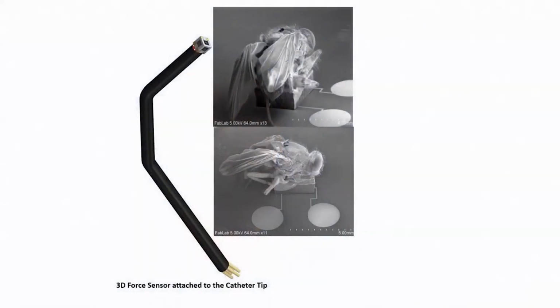Right now, this is a dead housefly that we stuck with silver paste on a flexible force sensor, and we took an SEM image. Along with taking a measurement, we have taken the SEM image. So, having said that, let us move further.